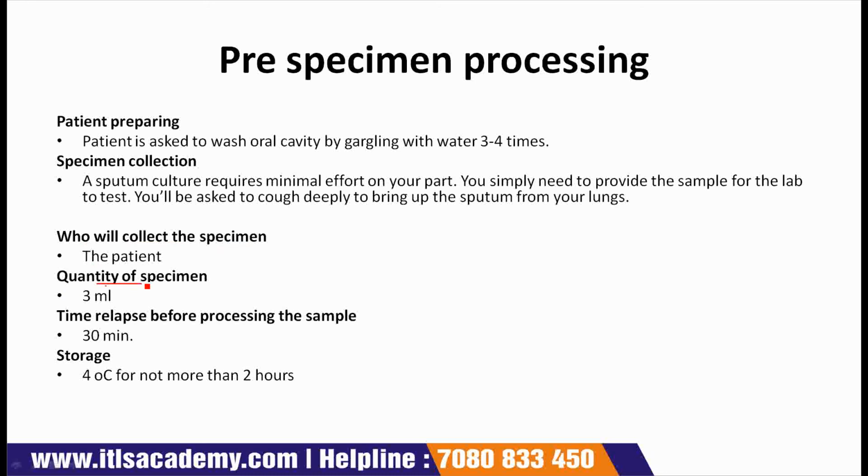Quantity of specimen should be 3 ml. Time lapse before processing the sample is 30 minutes. Next comes storage, and storage is 4 degrees centigrade for not more than 2 hours.